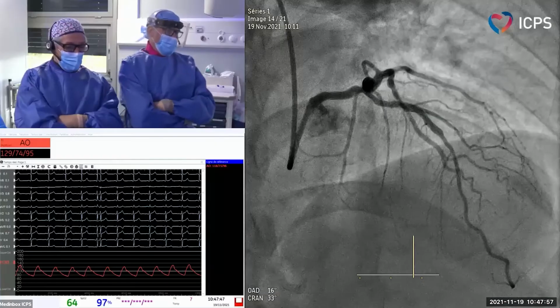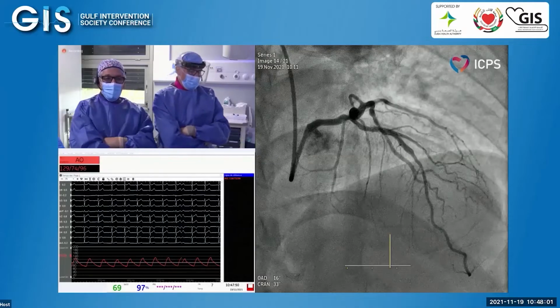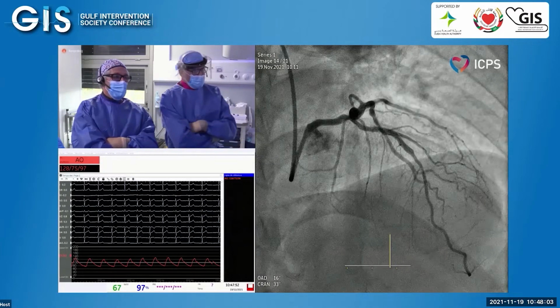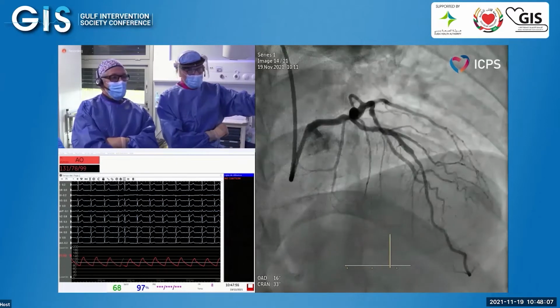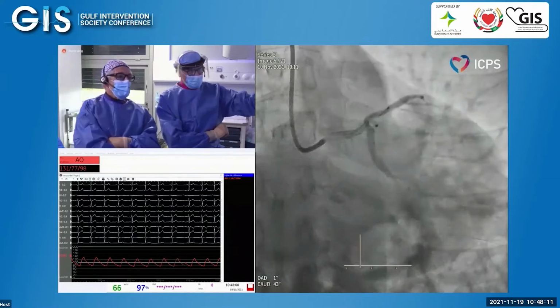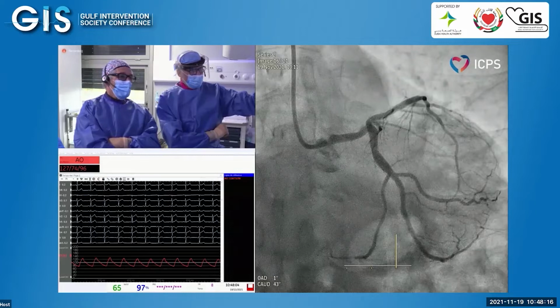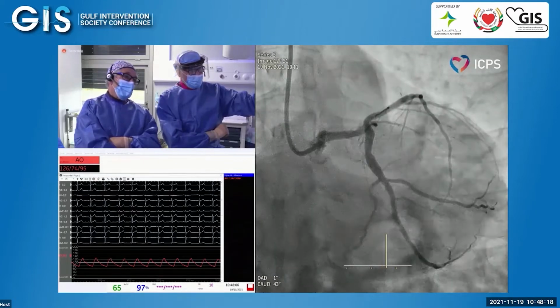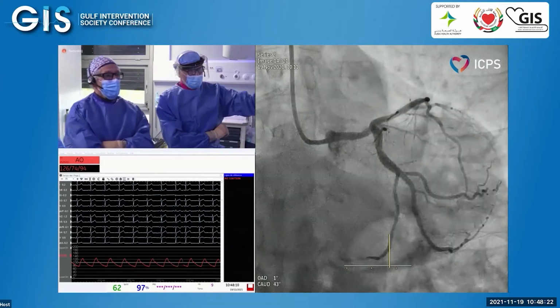Okay. I agree that the ostium of the circumflex artery looks big and large, although in some of the views we cannot see it very well. There is some little progression, I agree with the previous comment, in the ostial LAD, and even the distal left main, it's hazy. It's not that narrow, it's not that stenosed, but it is disease.